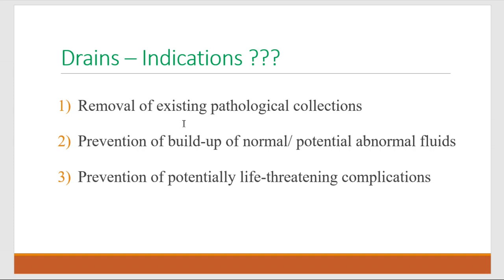If we want to prevent it, the drain can be used. Even if something is coming out in the post-operative period, the intra-abdominal pressure will not rise if we have used the drain. And early detection of the disease status we can do, and accordingly we can take decisions.